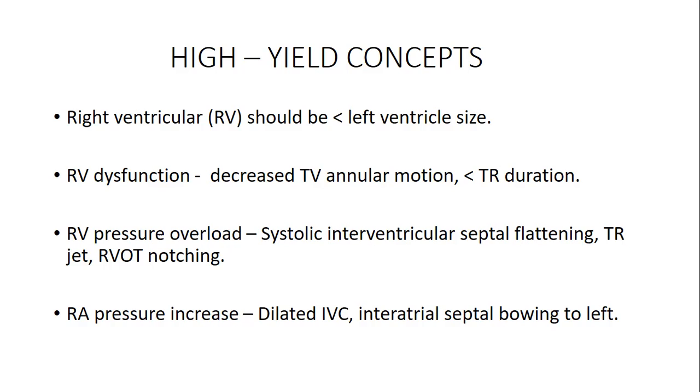So when you see a D-shaped right ventricle, what does it mean to a cardiac sonographer? What does it indicate? What is the clinical implication? What are the hemodynamics that are happening there? This is why these concepts are coming in.